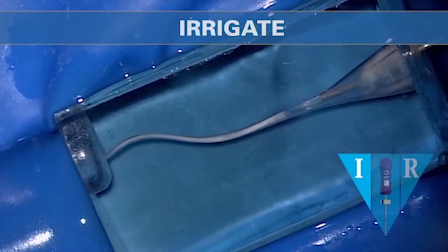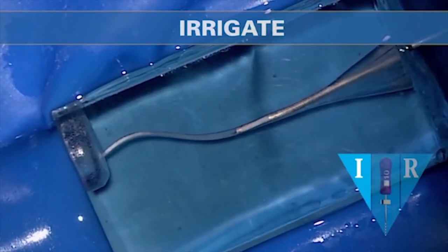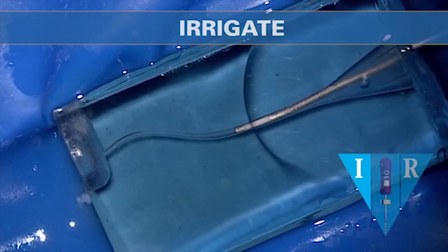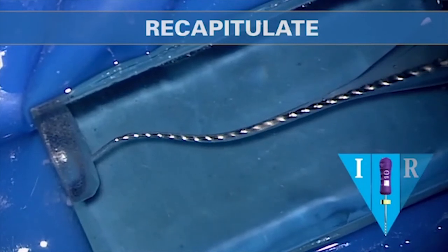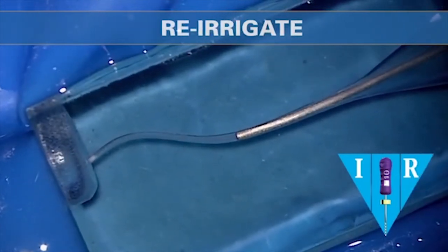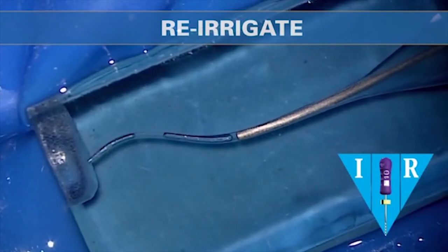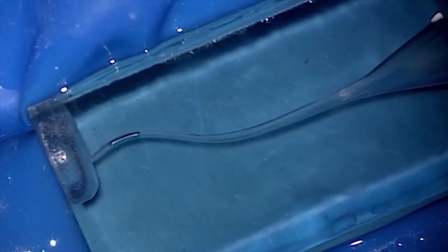When you pull any mechanical file out of a canal, it's important to irrigate. Irrigation kicks out gross debris. Then we can recapitulate with a 10 file, or you can recapitulate with the ProGlider — either instrument is able to break up debris and move it into solution so that it's loose debris, and that loose debris can be liberated from the canal when we re-irrigate. Notice the cannula doesn't need to go deep — it only needs to go about to the middle one-third of the entire working length, and I can irrigate and vacuum. I'm using a 25-cent syringe with a 29-gauge cannula.